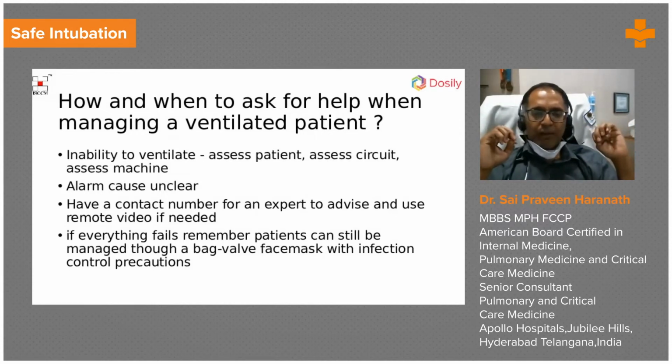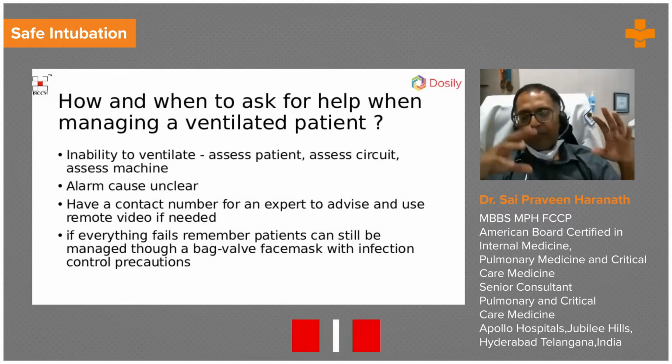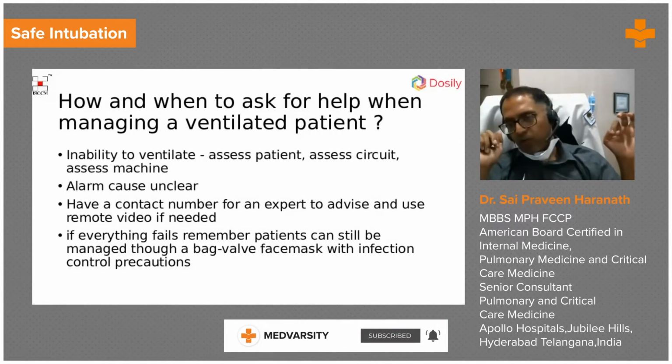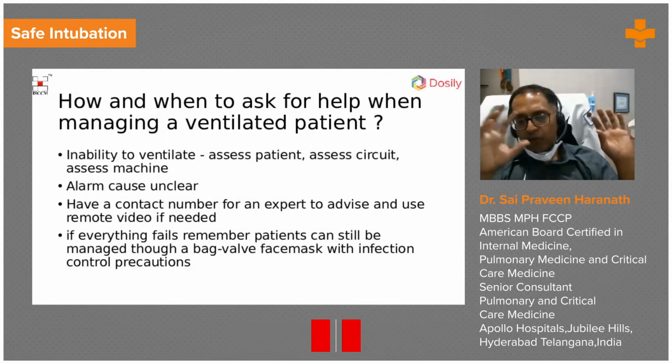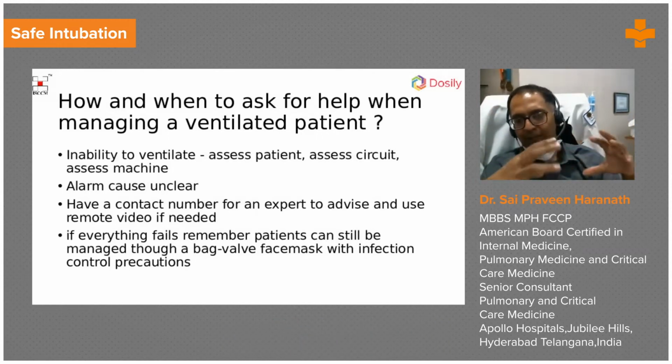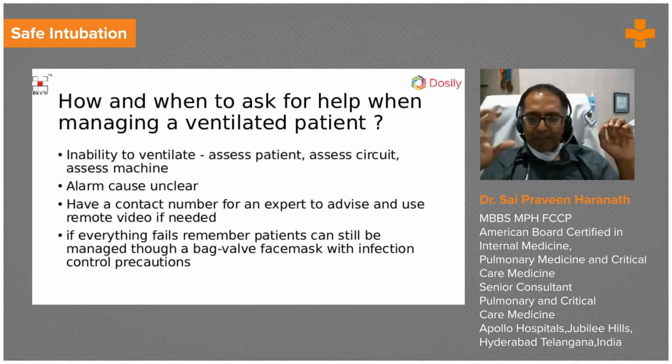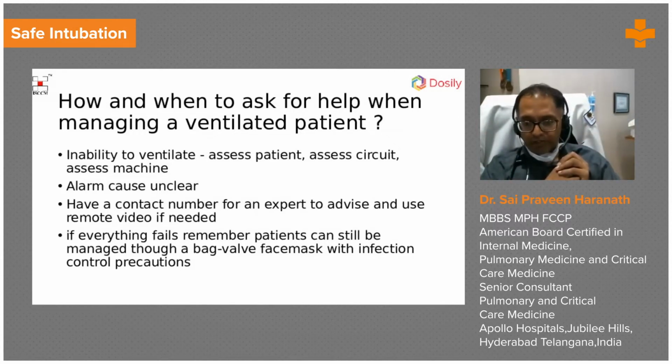Have a contact number for an expert to advise you in your own ecosystem, where in a hospital, it might be an anesthetist, it might be a critical care expert. They may not even be in your own hospital. And try to use a remote video to show the waveforms if possible, as long as you have the correct privacy protection and confidentiality for the patient. If everything else fails, remember that you can always bag the patient with an ambu bag or a Bain circuit, being careful with the infection precautions.